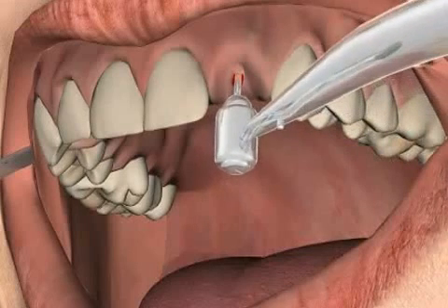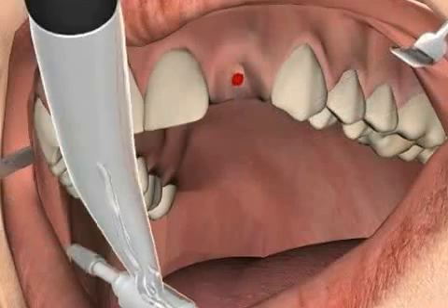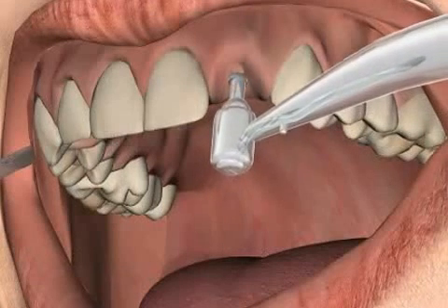After punching, the implant drill hole is refurbished using various instruments. This step may appear to be simple, but it requires considerable experience on behalf of the implantologist. During this step, he or she will evaluate bone quality.